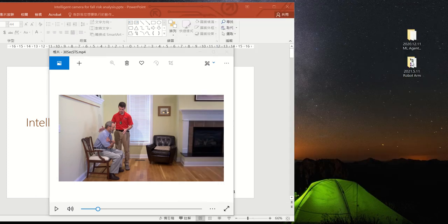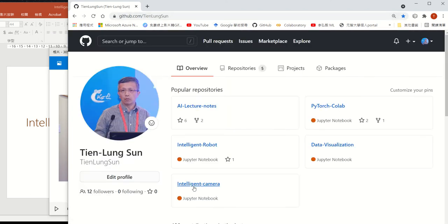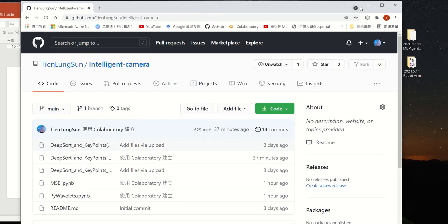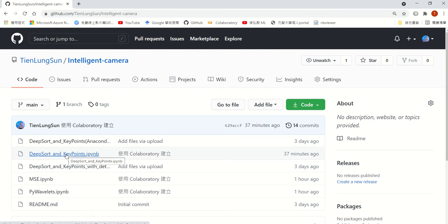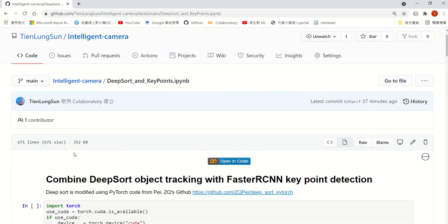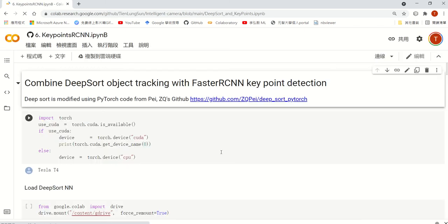So first you go to my GitHub, then go to this intelligent camera, and then you open this DeepSort and the key points. The first program is for Anaconda. Once you open it, it's very nice. You can open my program in Colab directly. Just click this open in Colab. Of course, you have to log in to Google first.